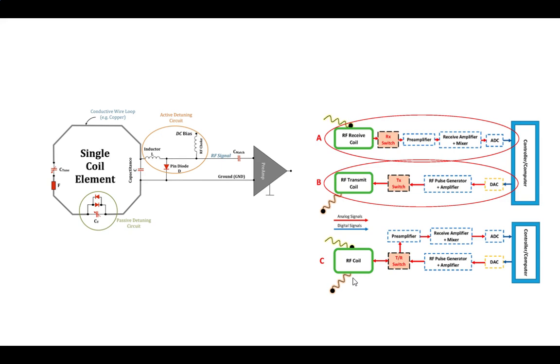Essentially, you set a DC bias, you turn that on, and you bias this individual diode here so that it's just on. You're bypassing that part and introducing this different inductance. So now you've got a different path going through there, an alternate routing, and a different inductance means it detunes by that amount. Does that make sense? So that's the whole trick to that DC bias one. The DC bias just biases this PIN diode, giving you an alternate route. Otherwise, it's not enough to bias it and it's done.